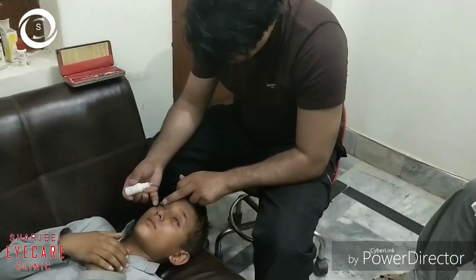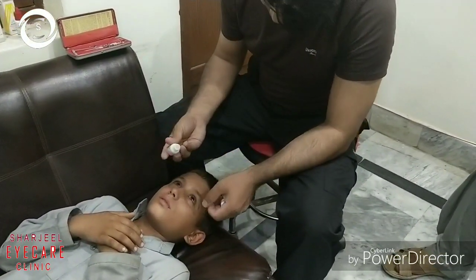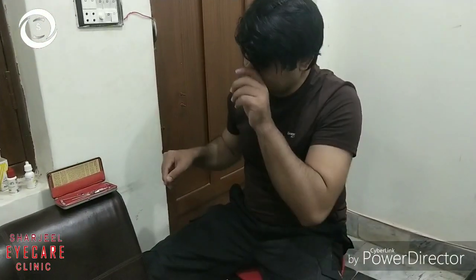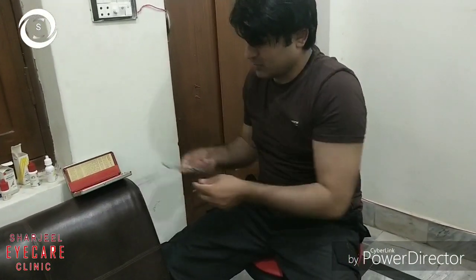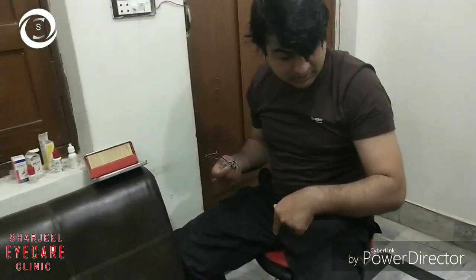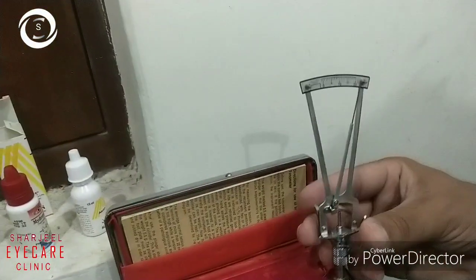In this video we will show three patients: first, vernal keratoconjunctivitis — a child with normal intraocular pressure. After each measurement, clean the foot plate with a spirit-soaked cotton swab. Make the patient supine, tell them to hold their right hand thumb in front of the eye to fixate on, then put topical drops in both eyes.